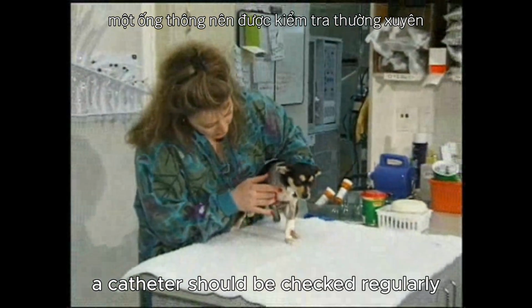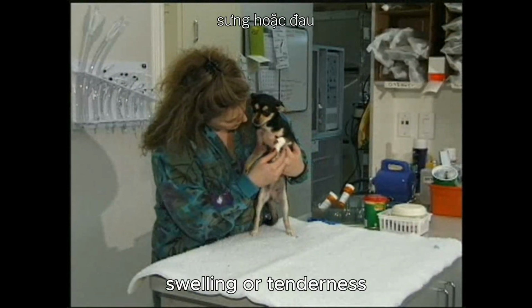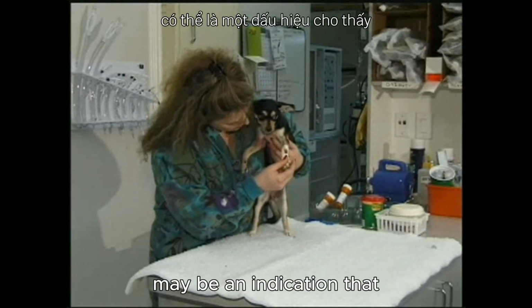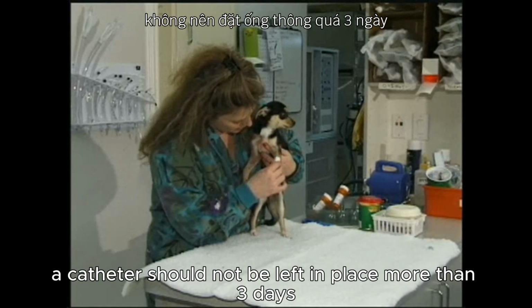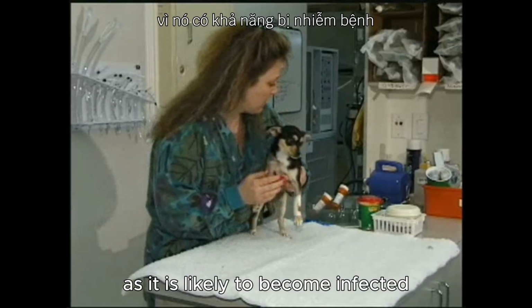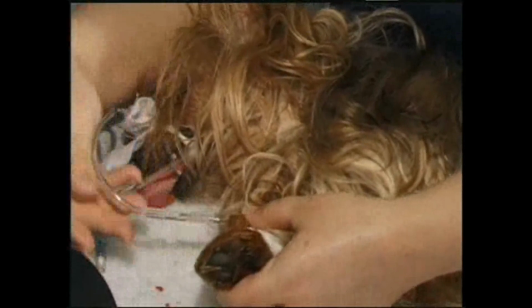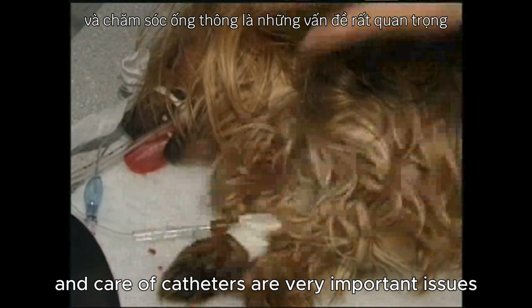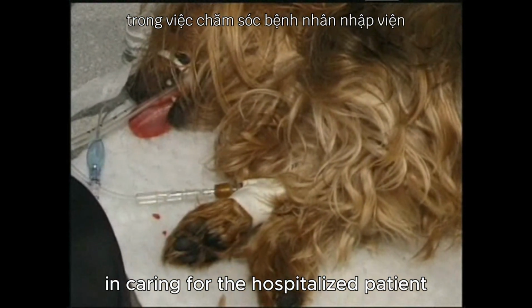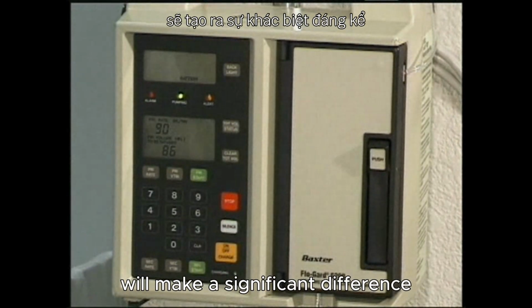A catheter should be checked regularly to assure that it is still in the vein. Swelling or tenderness may be an indication that the catheter needs to be changed. A catheter should not be left in place more than 3 days, as it is likely to become infected or cause excessive inflammation. Proper administration of fluids and care of catheters are very important issues in caring for the hospitalized patient. Your attention to the steps discussed will make a significant difference.